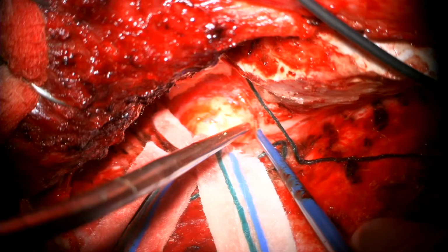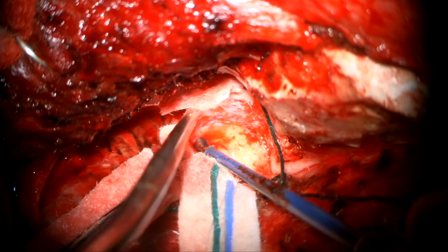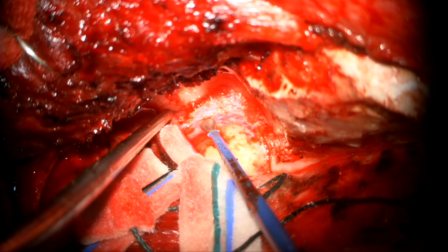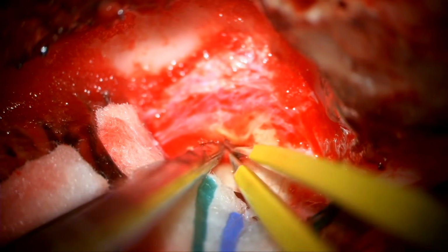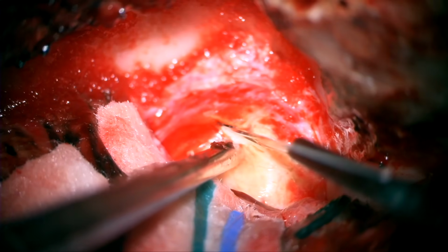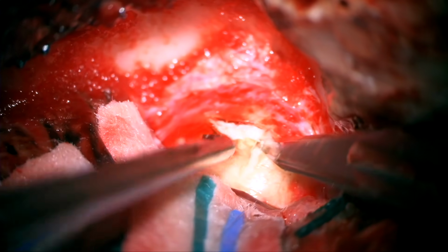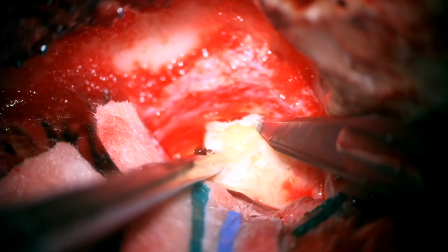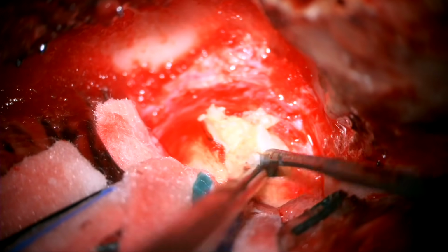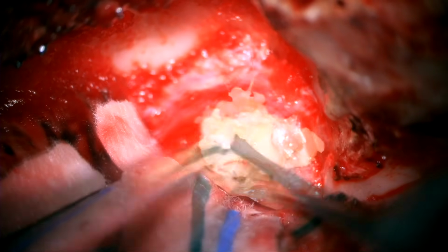We are now stimulating, finding the third nerve located at the roof of the cavernous sinus, just underneath the clinoid. We can see V2 displaced inferolaterally, and the whole dermoid cyst. We open the capsule, and again all is done in an extradural fashion with no fixed brain retraction. We identify the contents that are typical of a dermoid cyst.